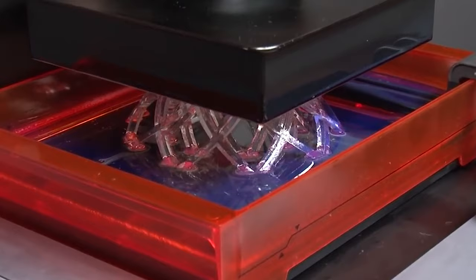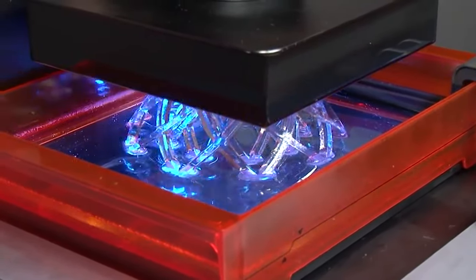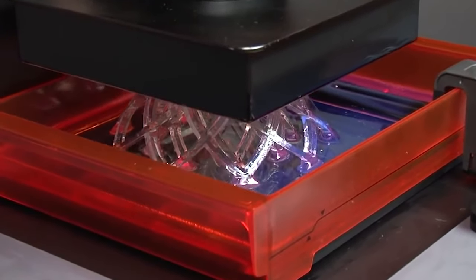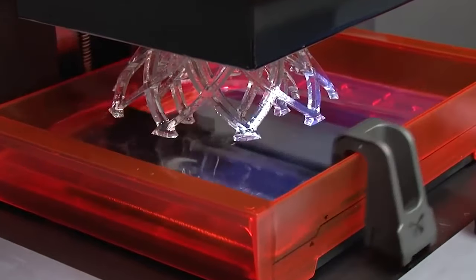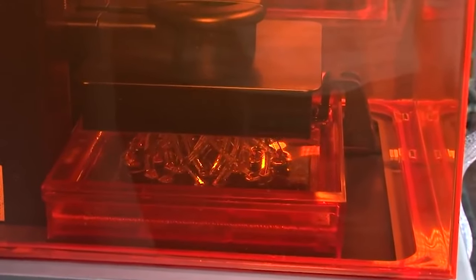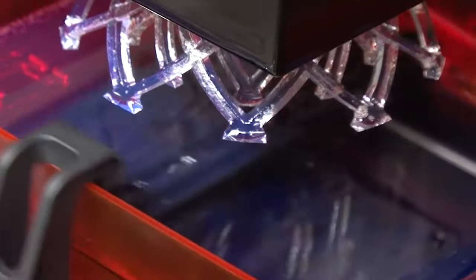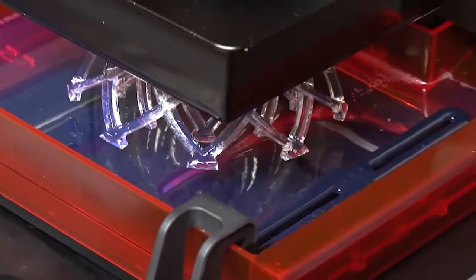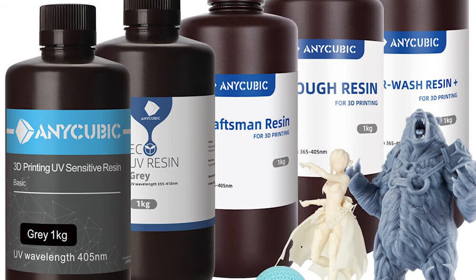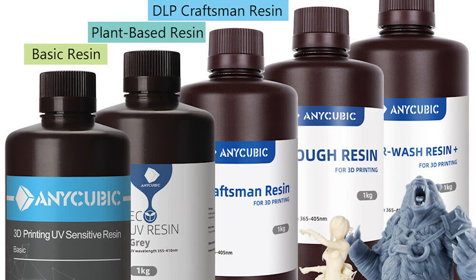Another technology that is used to 3D print orthopedic casts is resin or polymer 3D printing. Resin 3D printers print faster than FDM printers, and the surface of the finished models is much smoother. However, the technology has its drawbacks. For example, the models printed have to be post-processed. Moreover, the resin material used to make the 3D printed casts is quite expensive compared to the plastic filament used by FDM 3D printers.